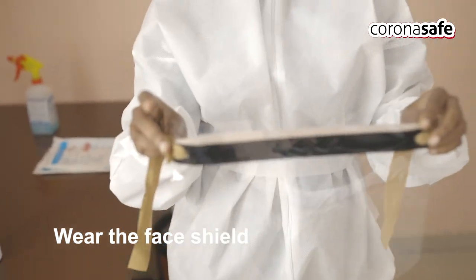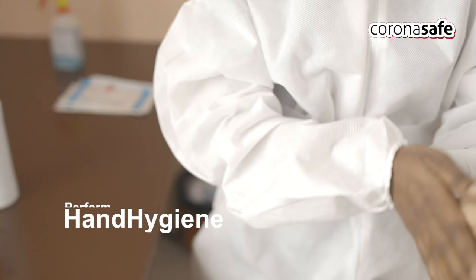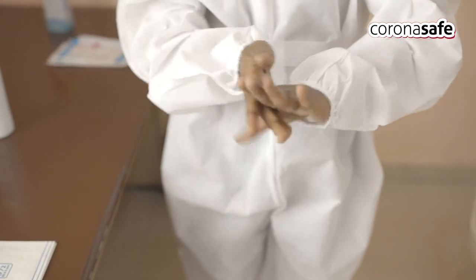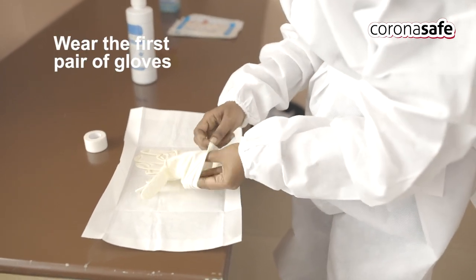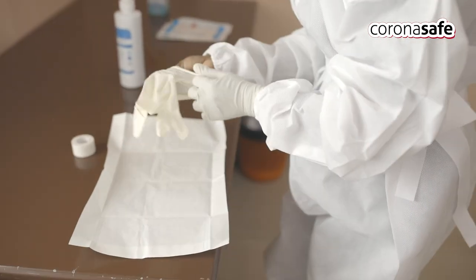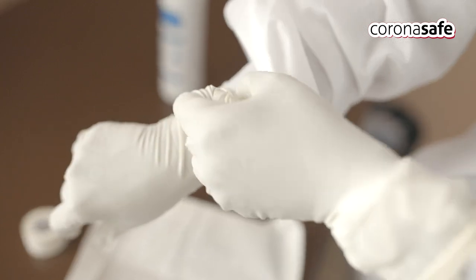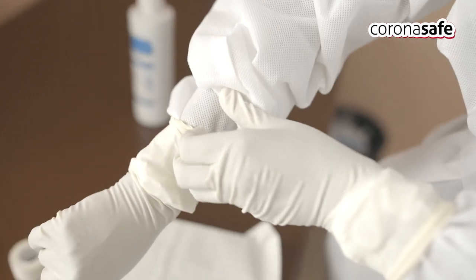Next, wear the face shield. Perform hand hygiene with 60–70% alcohol-based hand sanitizer. Wear the first pair of gloves of appropriate size and attach the cuff of the gloves to the coverall sleeves, tucking the sleeves well inside the gloves. Use micro-pore to attach the gloves and fold the end of the micro-pore for easy removal during the doffing process.